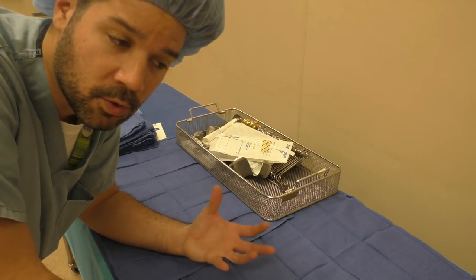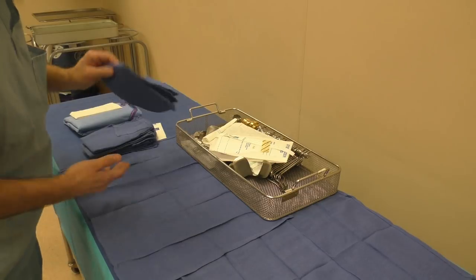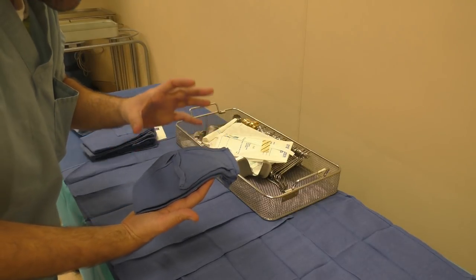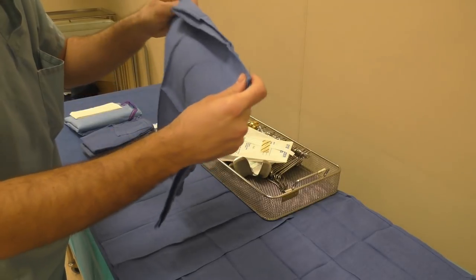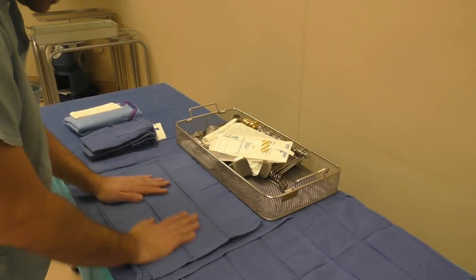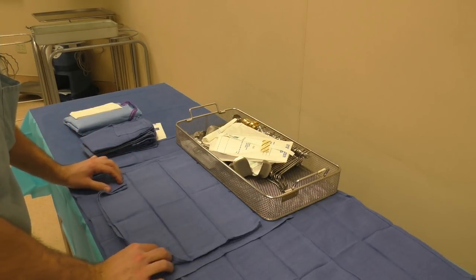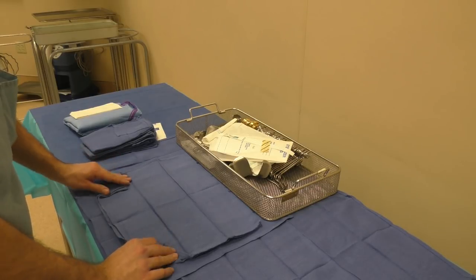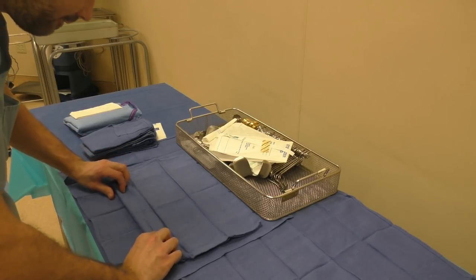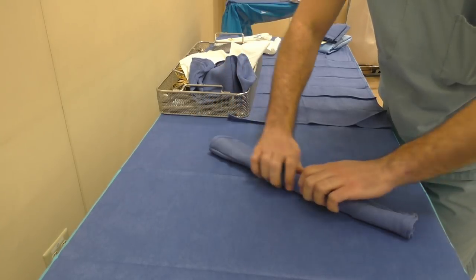Now we're going to go over the roll towel and a couple variations of the rolled instrument towel. First, let's look at the towel the way it's folded. We're going to open it up — it's basically folded in half and we're going to keep it that way. Lay it down on your table, flatten it out a little, angle the corners in, then start your tight roll with a big fold, a half fold into it, and then just roll into the towel itself to make a roll towel.